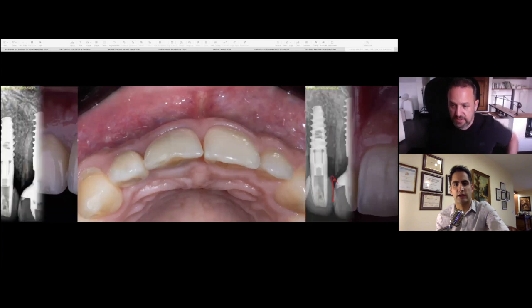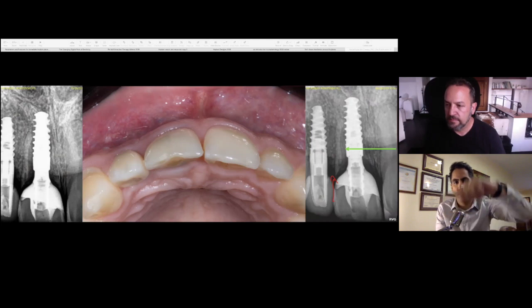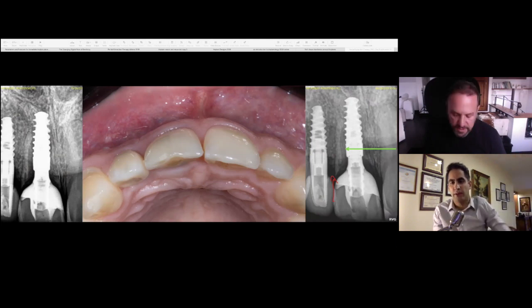Yes. Yeah, here, with this red arrow that you're showing, exactly. This is the part of the shield in the interproximal that has been saved. Okay, so I want to know, when we are saving the proximal part of the shield, should the level of the reduction be the same as the buccal, or should it follow the CEJ contour, going up in the proximal and a little bit lower in the buccal?